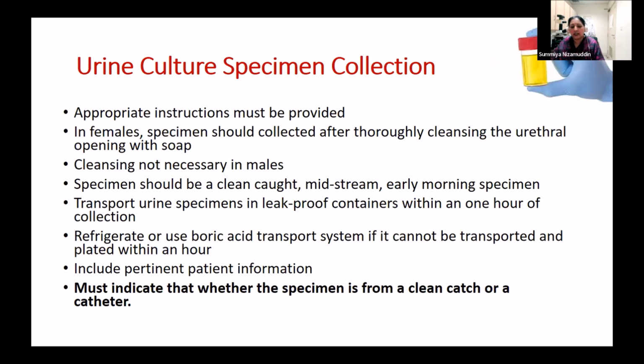We have to ensure that it's an early morning specimen. Urine UTI के लिए recommended यही है कि सुबह का पहला पेशाब हो. Early morning specimens need to be submitted. It's a clean catch urine, a clean midstream urine. So what do we mean by clean catch urine?